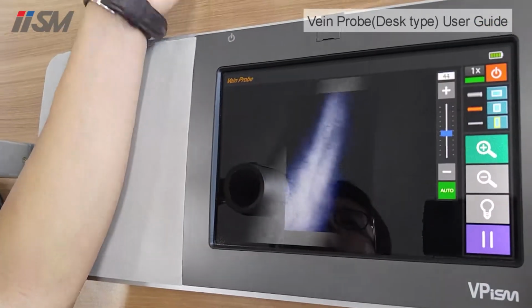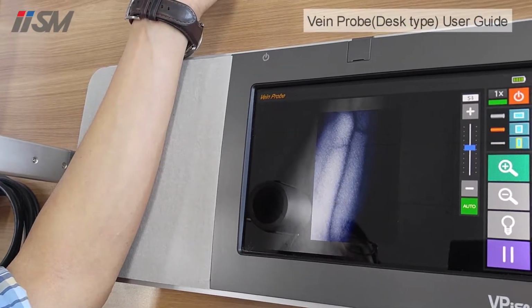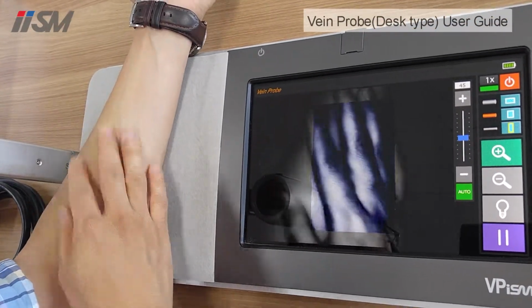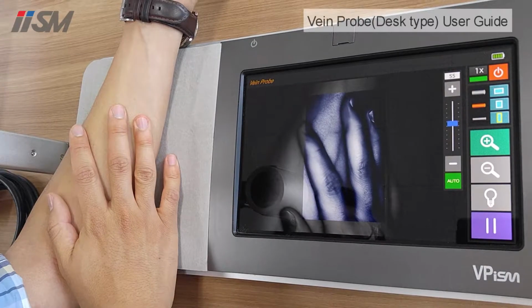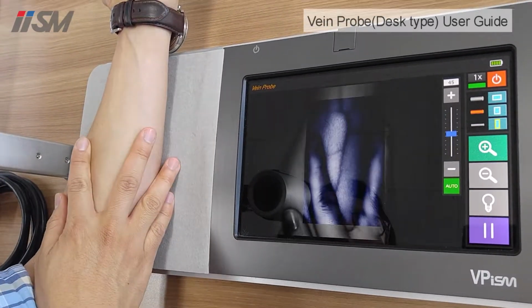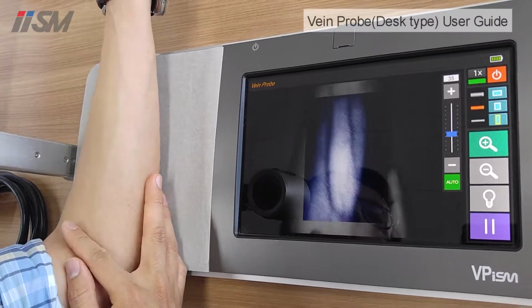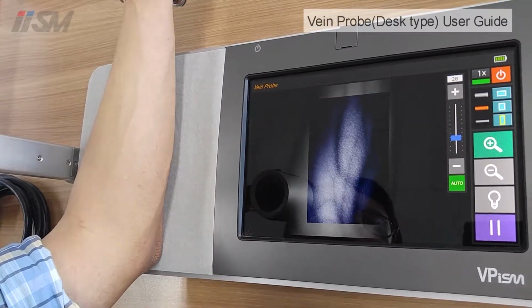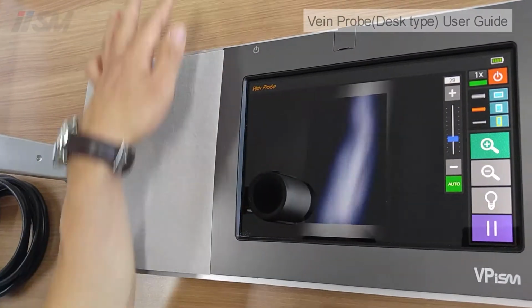Okay, and also you have to remember that your target area must be lower in height compared to your heart, so that there will be more blood flowing to the target area for better observation.